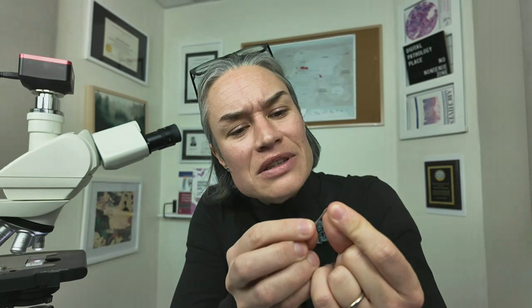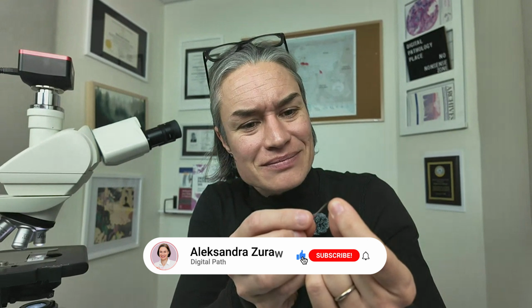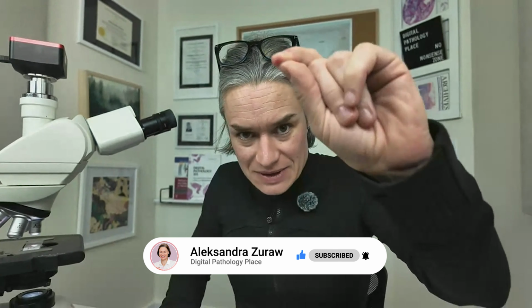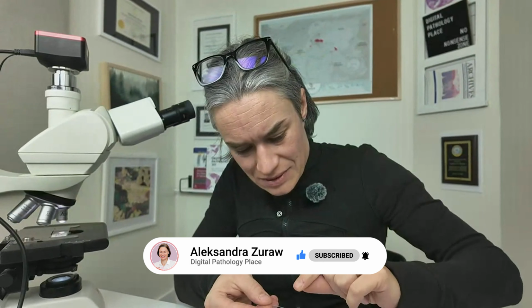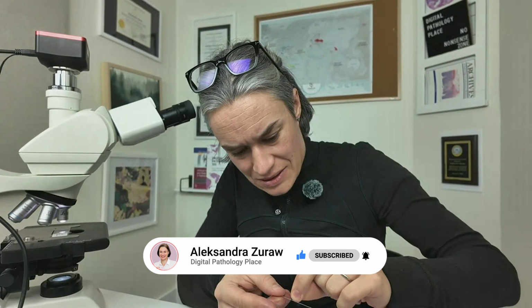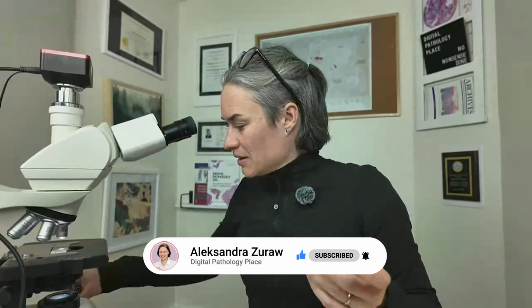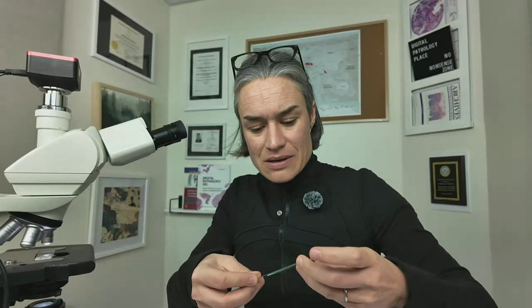I don't want to hurt myself very much, just a little bit. Okay, I have something. I'm going to do a few dots. Let me take a different one to make kind of a smear. And let's see how it looks under the microscope. I'm taking out the other slide.